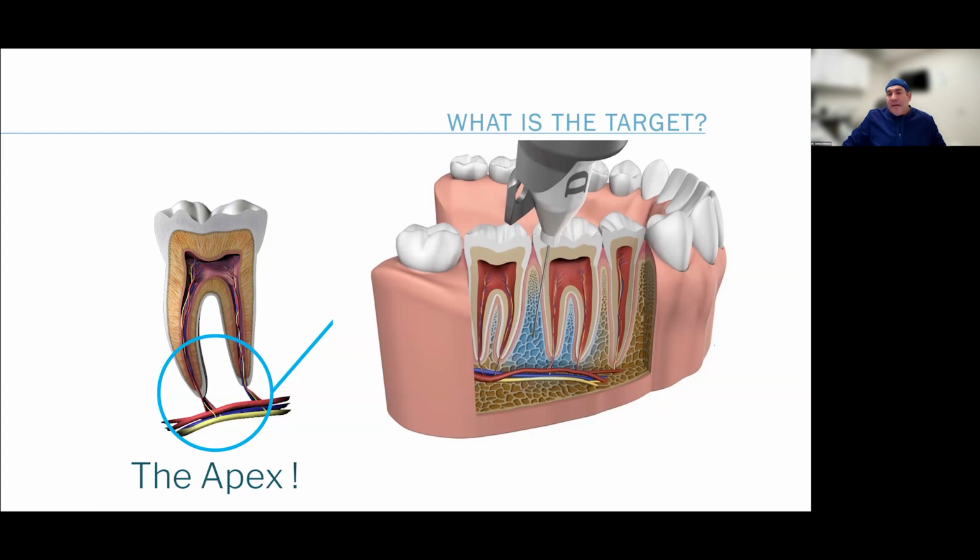Now, when I think about giving a block to a patient, it seems so foreign to me. Someone had a great analogy: if I need to numb my finger, why would I give a block at my elbow? You can numb your finger that way, right? But you're going to have all this other anatomy numb along the way. You're going to have to give a higher volume. You're going to have to numb these other accessory structures, and it's going to take much more time. If I need to numb my finger, I just want my finger numb. And that's exactly what's happening with these devices.